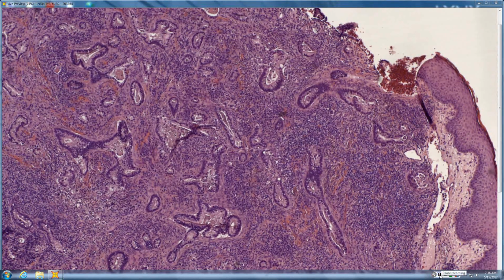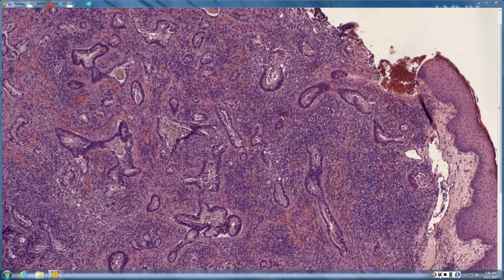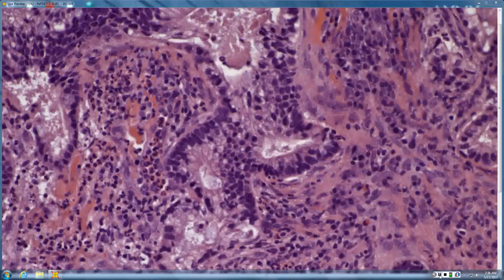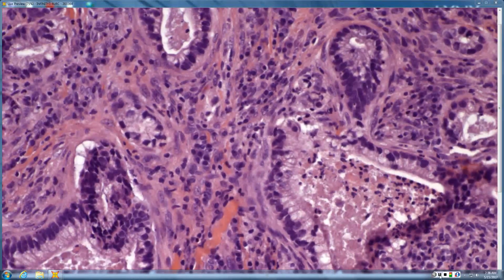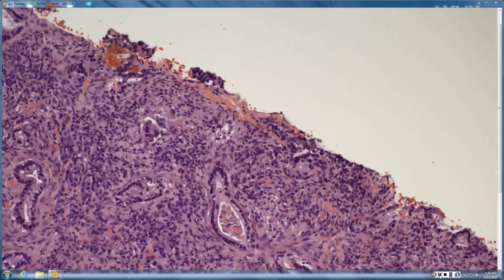So you have these glandular structures in the dermis. From here, I worry a little bit about an adenocarcinoma. So certainly looks hypercellular. They're not particularly round or oval. They're bizarre irregular shapes. When you look at the center, there are a few inflammatory cells, but there's also a lot of dirty necrosis in the center. Some goblet-type cells. So what are you thinking? Worry about like metastatic colon.